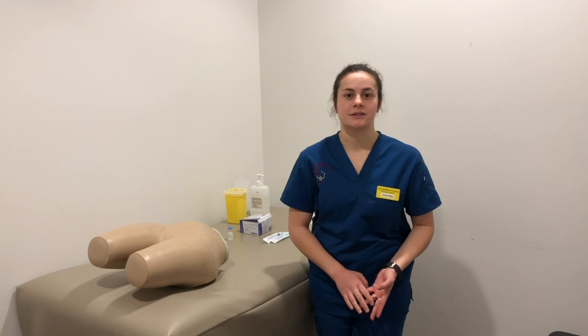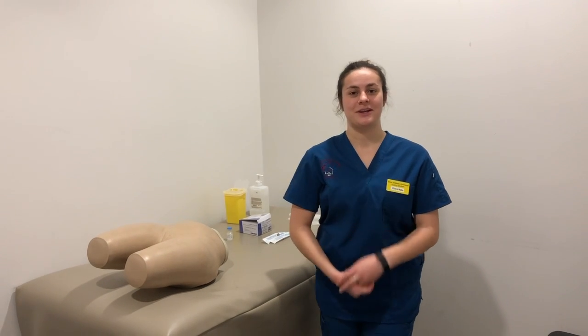I am going to be doing a video on the technique of injections today, along with the proper techniques and how to appropriately administer the medication.